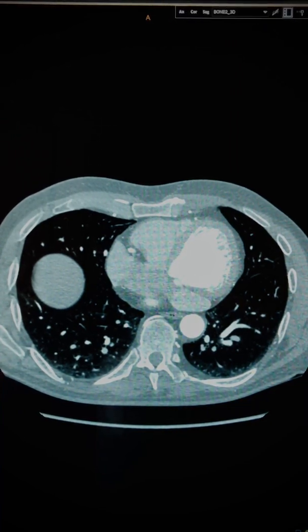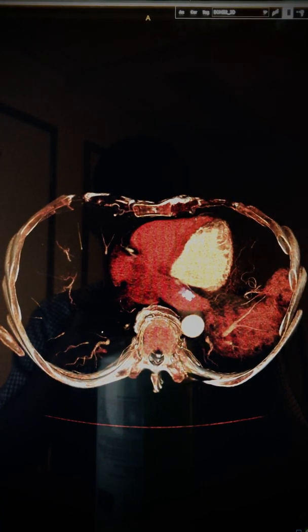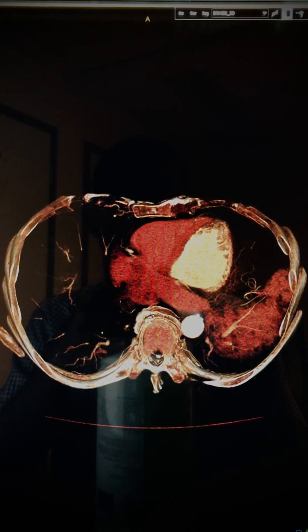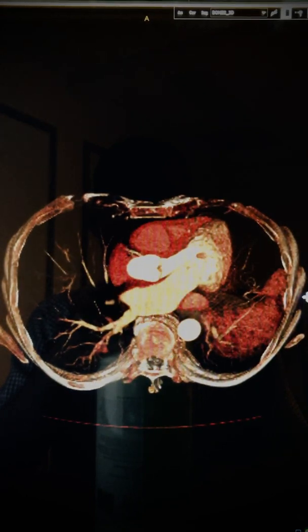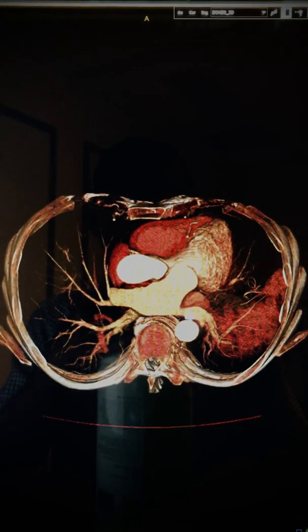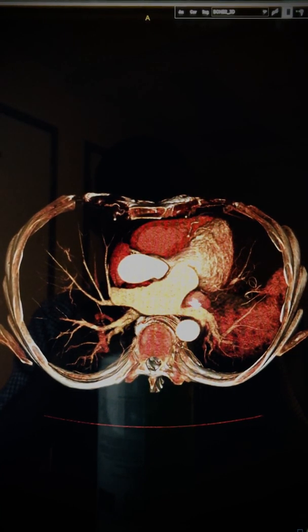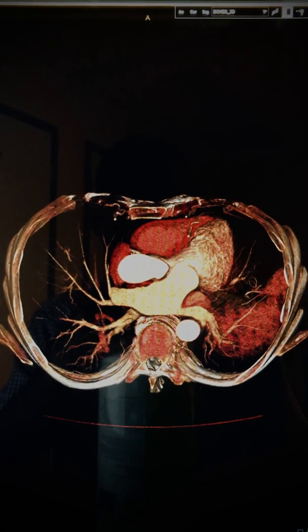In this particular case, let's follow the coronary sinus superiorly. You've got the descending thoracic aorta at its posterior aspect. We're going to scroll through the scan as we go upwards. You can see it continues through in front of the left-sided pulmonary veins.